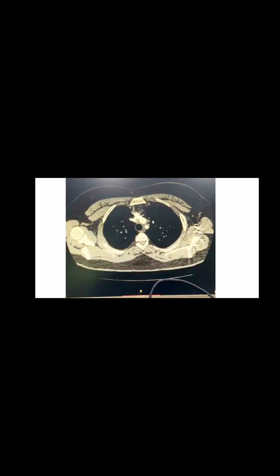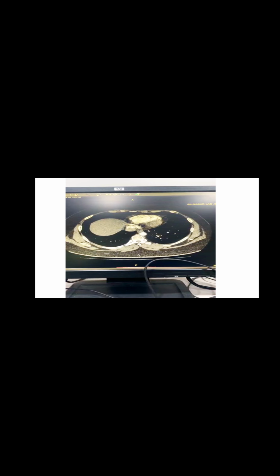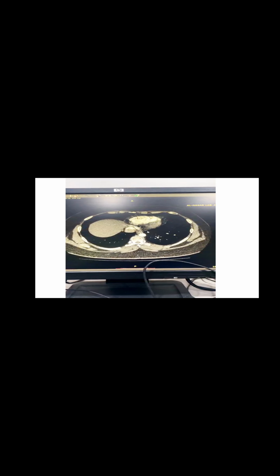Here is another view of the same patient. In this view you can also appreciate the Polo-Mint sign. Here, pulmonary embolism in bilateral pulmonary arteries, Polo-Mint sign. So why do we need to determine severity of pulmonary embolism? The answer lies in management.